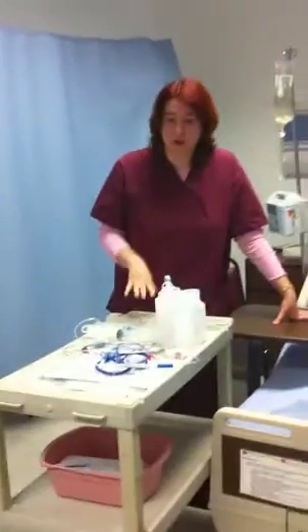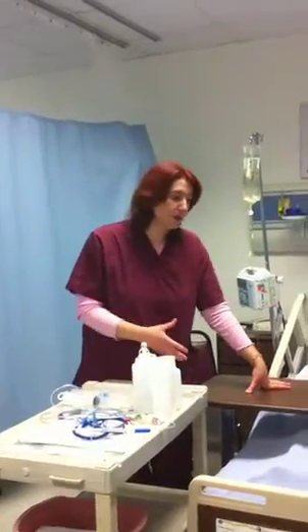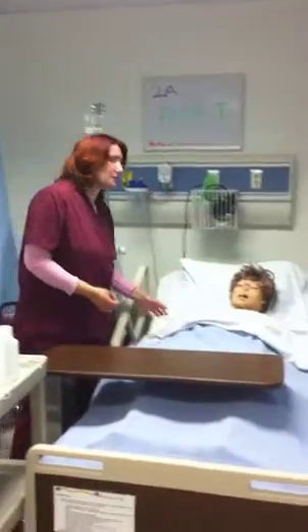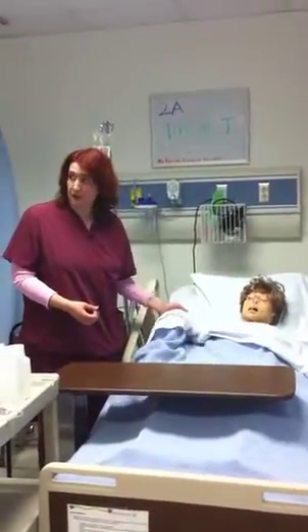For this procedure, you have to have a doctor's order, and you need to verify the order before you do anything. For placement of nasogastric tubing, you need to get a doctor's order. So the first thing, you check the chart and make sure you have the right order, and then when you enter the patient's room, of course, beforehand, you wash your hands, universal precaution. You go ahead and introduce yourself to the patient if you haven't done that already.